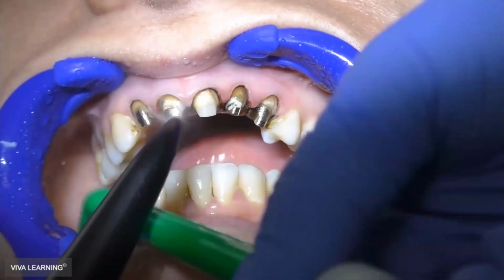So the main idea is you are still placing a 000 retraction cord here. Make the preparation, so you just place it to push the gingiva away, so you will not touch the gingiva with the burr. After you've done the preparation, place the retraction paste, wash it, and then take the impression, no matter if it's an analog or a digital impression.